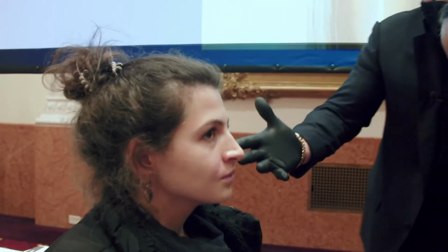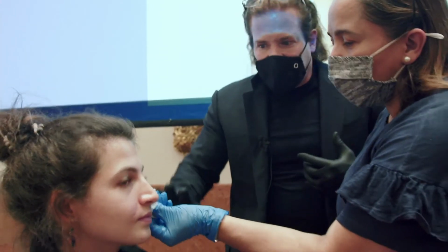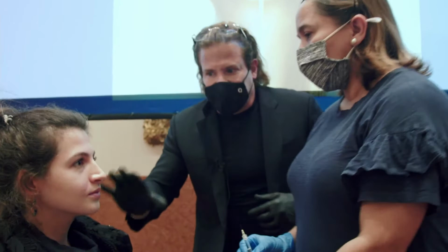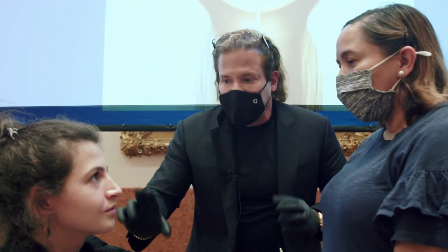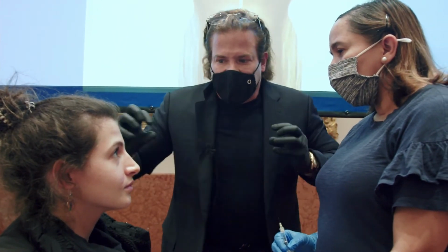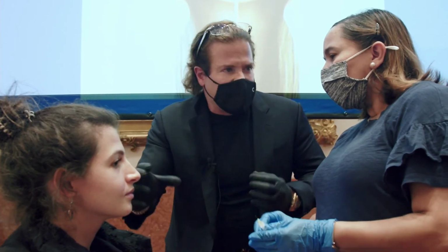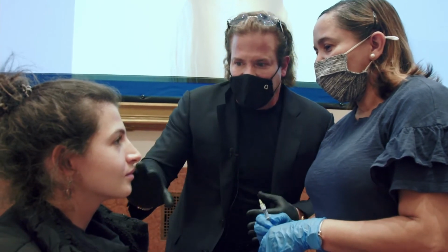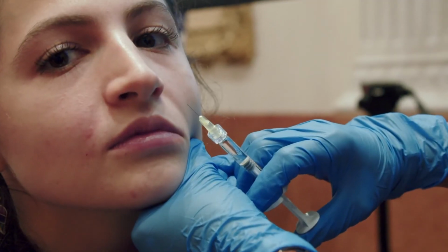But again, we're doing this because it's a teaching program. She's letting you do this, but she doesn't really need injections into the nasolabial fold. If she were coming in and this were my patient, I wouldn't say we're going to inject her nasolabial fold. If anything, I would work on her cheeks, and that would bring it up. But there's no harm in this, and she's getting a little bit in that area, and it'll puff it up. Just for the audience, I want everybody to know that would not be the first line treatment for her. Oh, that's good.